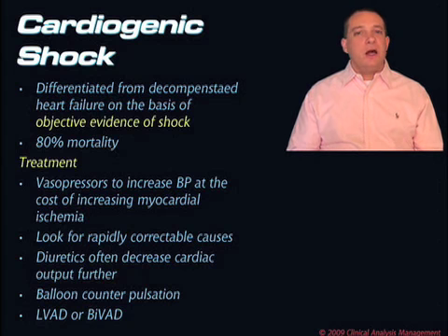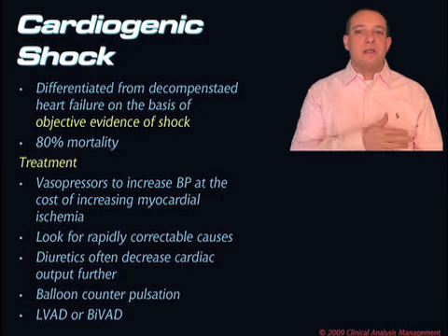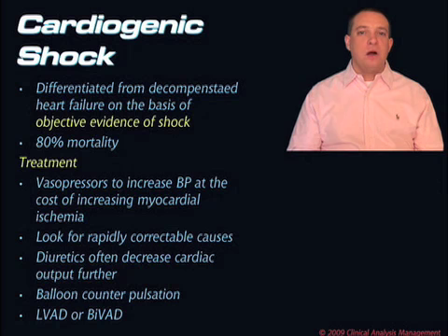Now, interestingly enough, when we talk about LVADs specifically, they're designed to work for up to about 100 days, but we've actually seen that we've put LVADs in people for a lot longer, and they've actually done really, really well. And we've seen that LVADs can actually decrease the workload on the heart so much, can actually augment cardiac output so much that patients actually start to heal their heart. Their heart actually starts to get better.